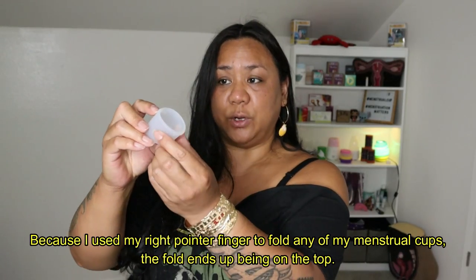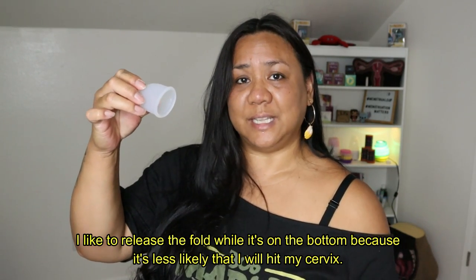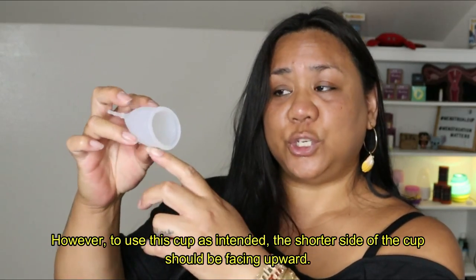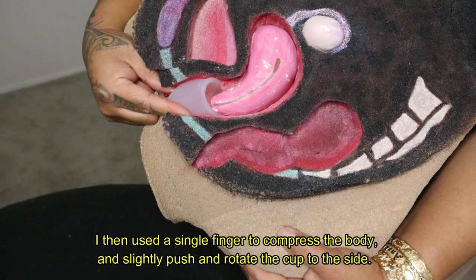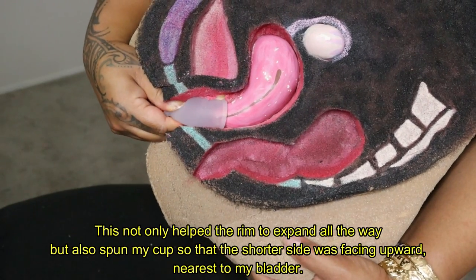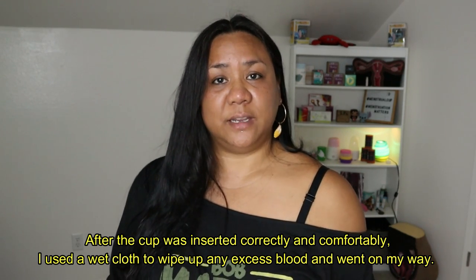Because I used my right pointer finger to fold my menstrual cups, the fold ends up being on the top. However, when I introduce the cup into my body, my hand automatically flips the cup upside down where the fold is on the bottom. I like to release the fold while it's on the bottom because it's less likely that I will hit my cervix. However, to use this cup as intended, the shorter side of the cup should be facing upward. To get this cup positioned correctly, I inserted the cup all the way in, then used a single finger to compress the body and slightly push and rotate the cup to the side. This not only helped the rim to expand all the way, but also spun my cup so that the shorter side was facing upward nearest to my bladder. After the cup was inserted correctly and comfortably, I used a wet cloth to wipe up any excess blood and went on my way.